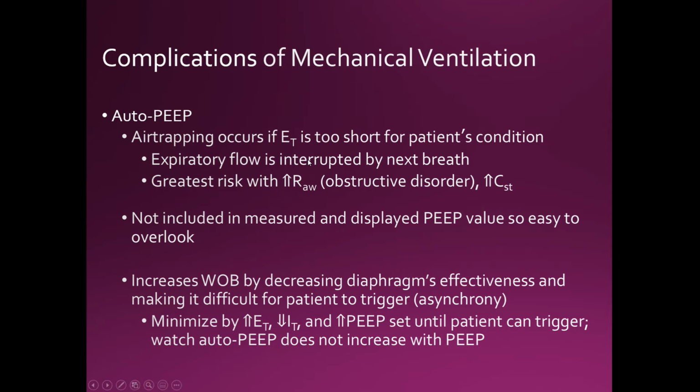Auto-PEEPing, again the same thing as air trapping, occurs if our expiratory time is too short for the patient's condition. Again, to fix that on volume control, we increase flow, which decreases I time and increases E time to prevent air trapping.